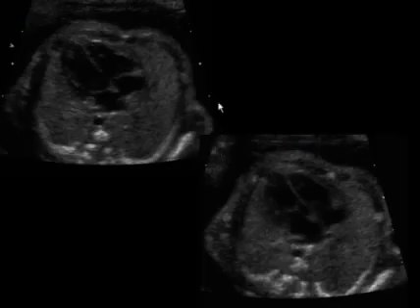So what do I mean by dropout? On this image of the four-chamber, we can see the interventricular septum here, and it gets very, very thin, and there's a suggestion that there's a big hole here between the right ventricle and the left ventricle. Could this be a VSD? Well, when we turn the image just a little bit, slide the probe a little bit more medially so that you're coming in perpendicular to the interventricular septum, you can see that that septum is intact all the way up to the root of the aorta.